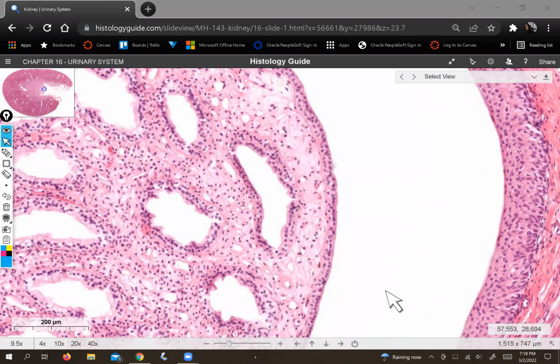And you'll notice that surrounding this very, very distal, deep medulla, there's pretty much just stromal cells. There's not really any thin or thick limbs anymore. We've just got papillary ducts anchored in stromal tissue because they're literally just here to drain urine into this minor calyx space.